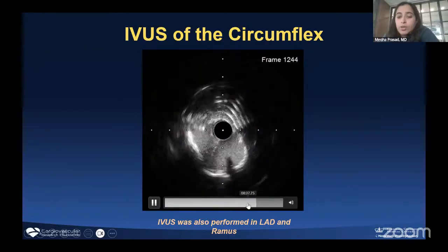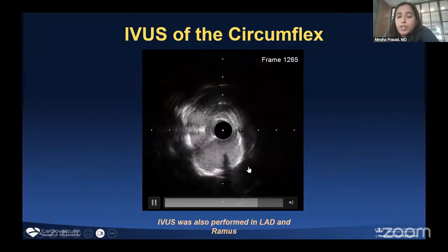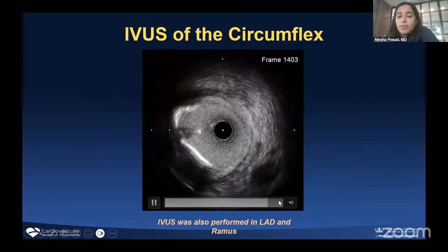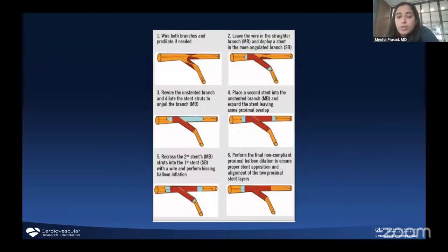So that was the bulk of the calcium here. And there were reverberations suggesting calcium fracture. And we did this in all 3 vessels and confirmed that. And then this comes into the left main. We marked our landing zone in the left main.